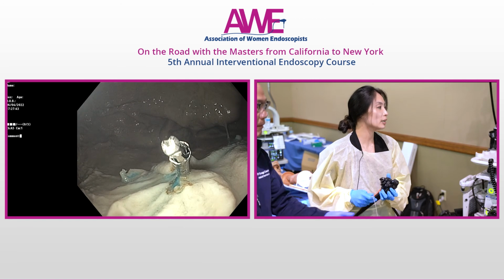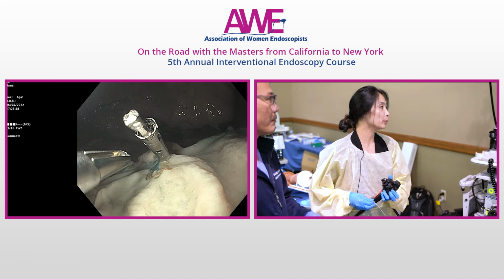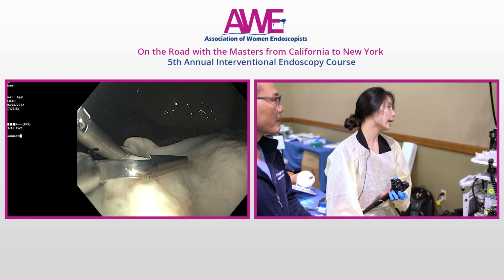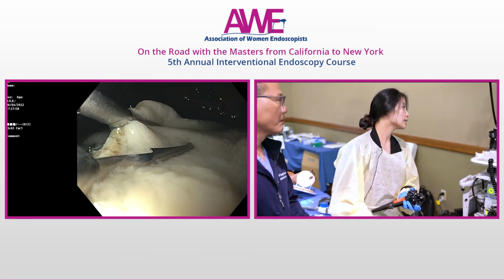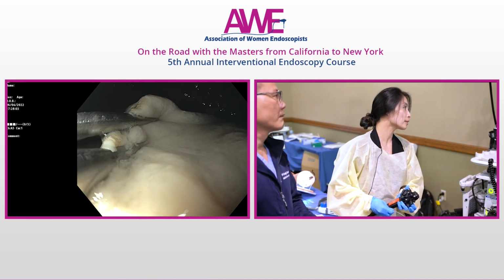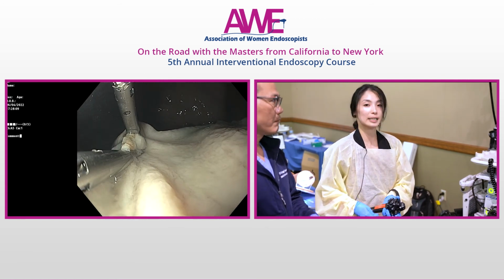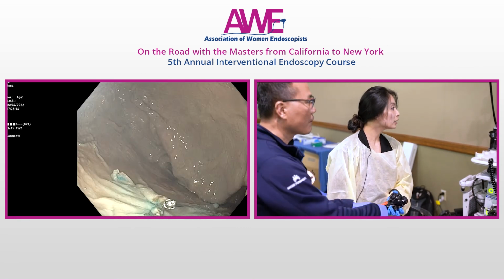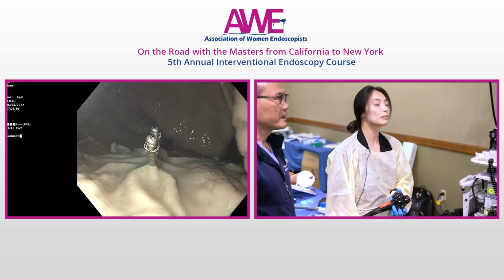I'm also suctioning the lumen to try to deflate, which will help me to bring the tissue together. So open. So again, I'm rotating it a little. I am angling down, making sure I have both sides of the defect, and giving some downward force, and suctioning a little as we close. And we can inspect and make sure we got both sides, and we can deploy. And it looks beautiful. Inspect our lesion, and it looks like we've been able to close it completely.